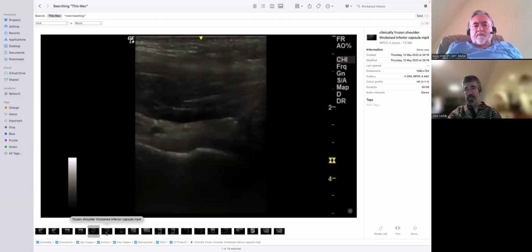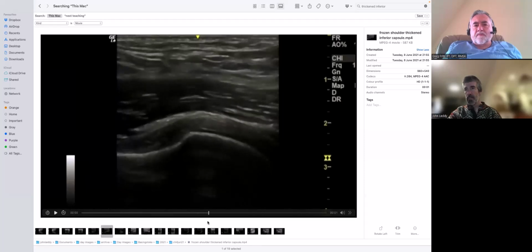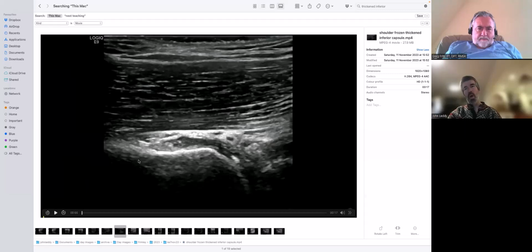See if I can find that one again. Yeah, that I think is acceptable, but it's still a little bit bumpy, and anything more than that is not a very normal shape of the bone. But if it's not like that, then you're asking the question: is this arthritis? And obviously they're the ones I showed you where it's OA.